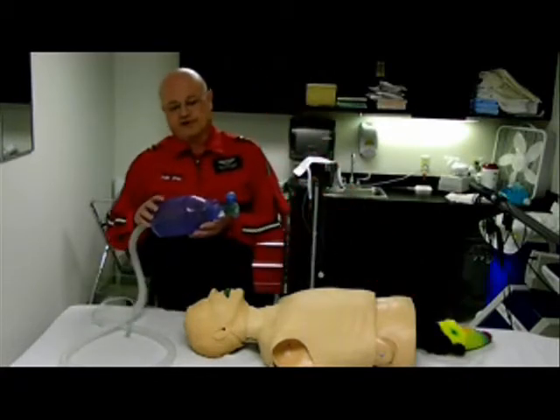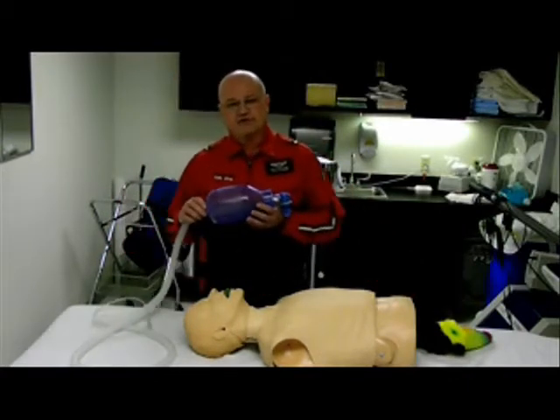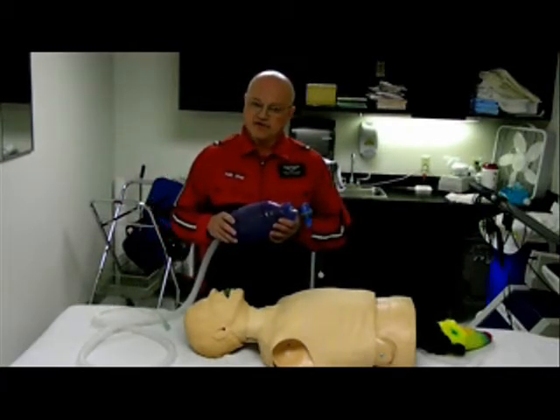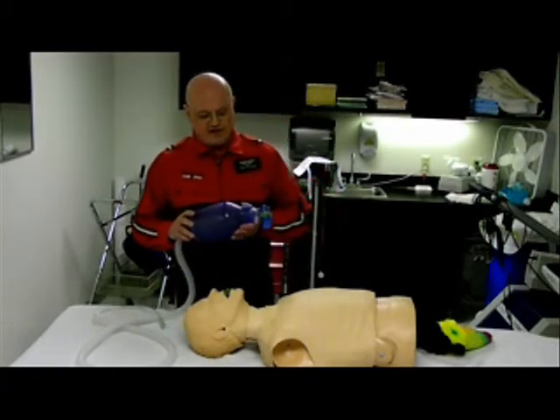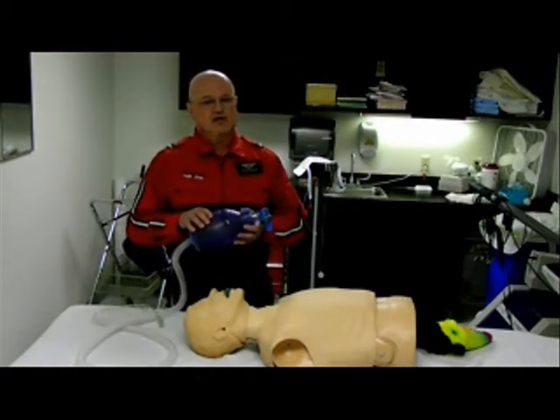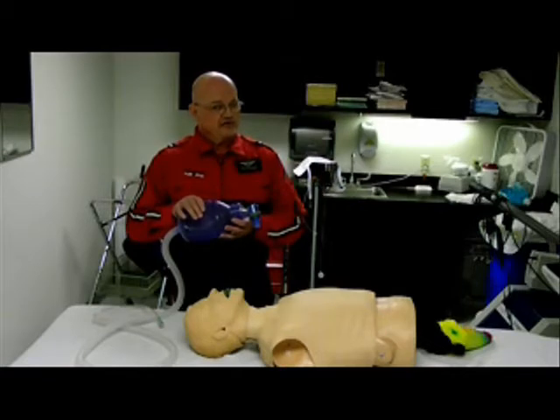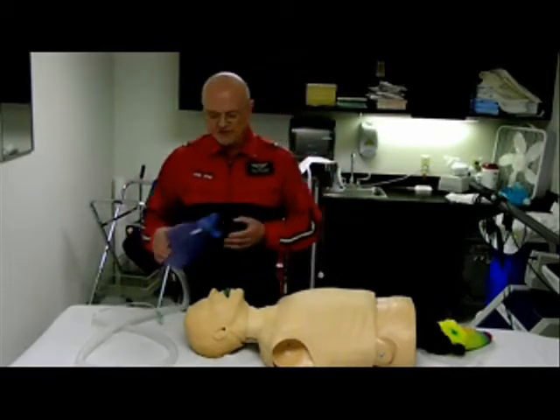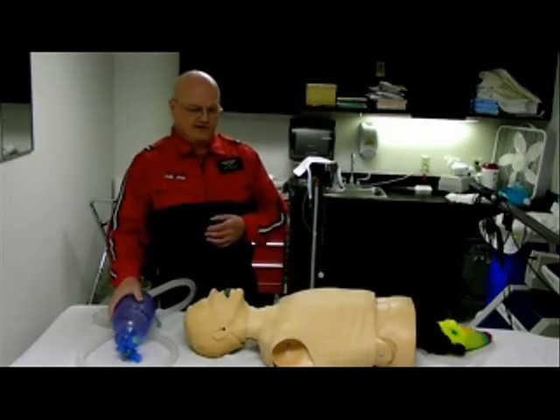The bag itself contains 1,500 cc's of air. The normal adult only needs 500 to 800 cc's. So when we squeeze the bag, we only want to squeeze it halfway. We want to squeeze it slowly, 1 to 2 seconds, at a rate of 10 to 12 breaths per minute — that's one every 5 to 6 seconds.